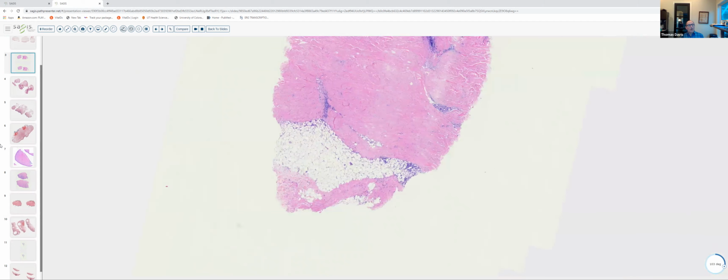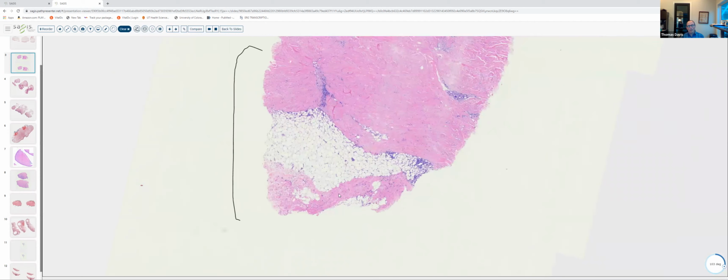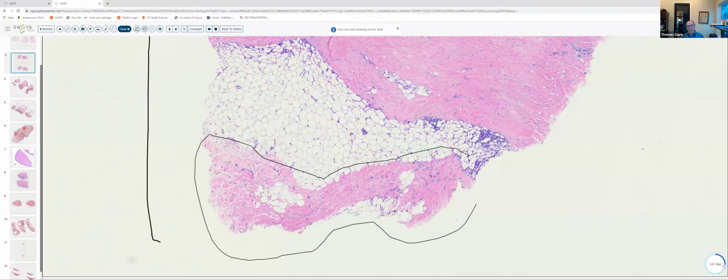And when that occurs, we talk about morphea profunda, kind of like we talk about lupus profundus when we see the changes of lupus in the fat. Now, whereas lupus produces a lobular panniculitis with hyaline necrosis of the adipocytes, in morphea, we actually see a septal panniculitis. So what you'll begin to see, and we can see a little bit of that here, the fibrous septae become thickened by very thickened sclerotic homogenized collagen bundles. So morphea is a little bit like necrobiosis lipoidica in that sense. Both of those conditions will produce more of a septal panniculitis than a lobular panniculitis.